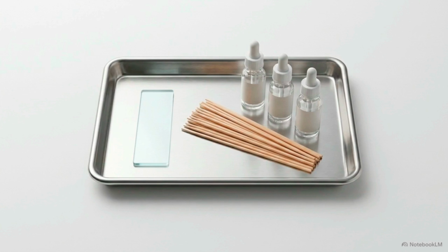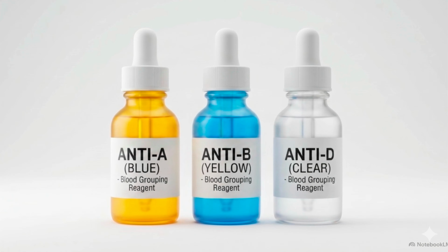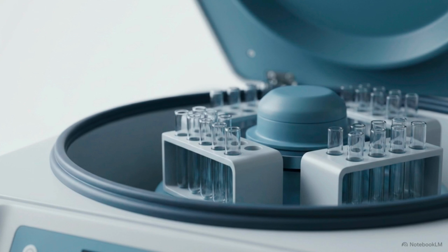Though the actual donor testing occurs after collection in the laboratory, it is mandatory and a part of the screening process before blood collection to screen for the donor's blood type through a slide method. This is a quick pre-collection screening tool to find out the donor's ABO and Rh group, though it does not replace the formal confirmatory tube testing performed later in the main laboratory.